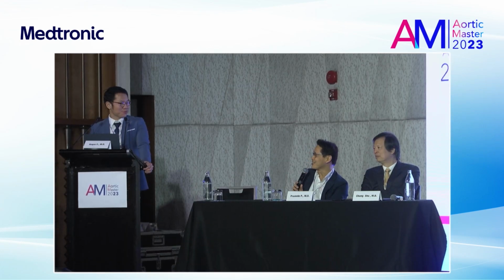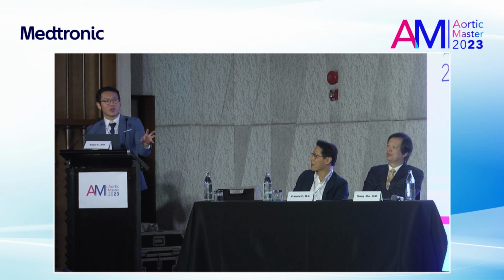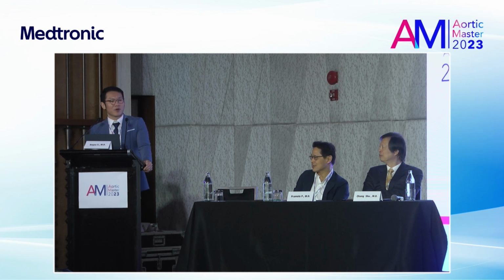Any panels have questions? Big question for the super secure anastomosis that you mentioned. Only one layer or two layers? Only one layer of this kind of technique. So your surgical graft will cover your anastomosis. So normally only one interrupted stitch around the anastomosis is enough. So no glue needed, no repair, very rare to repair this kind of anastomosis, very rare.